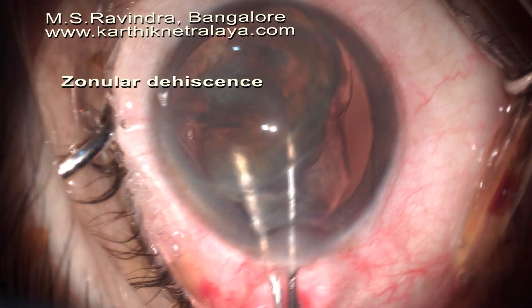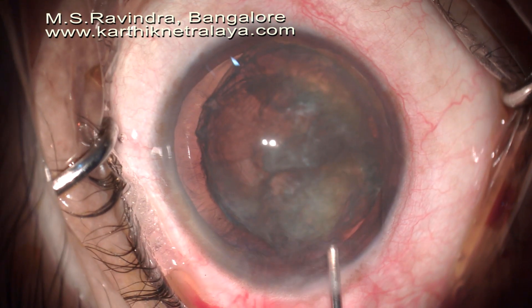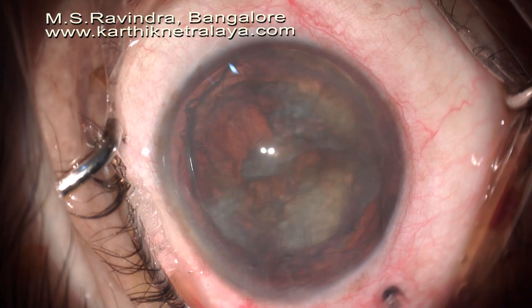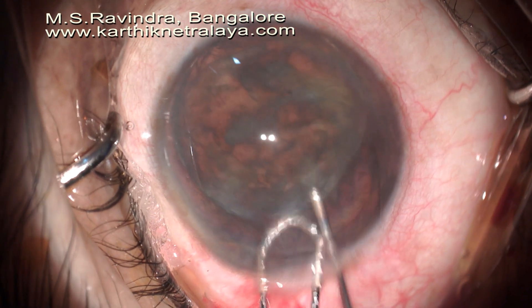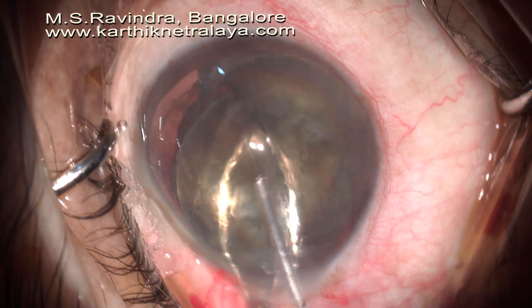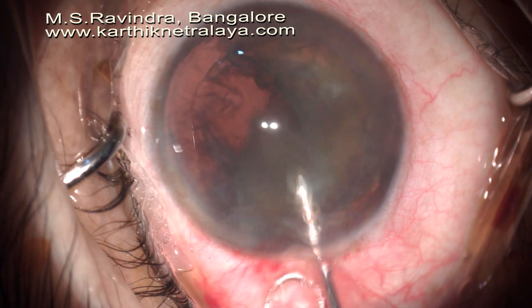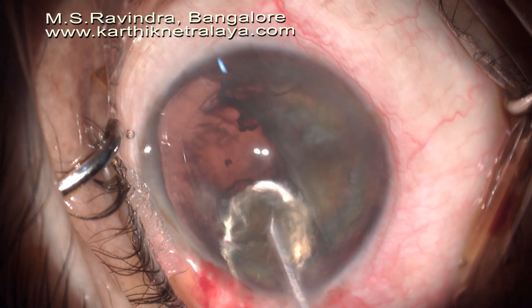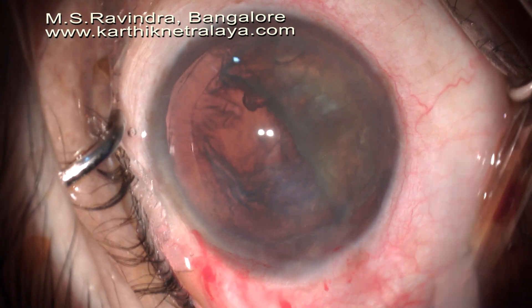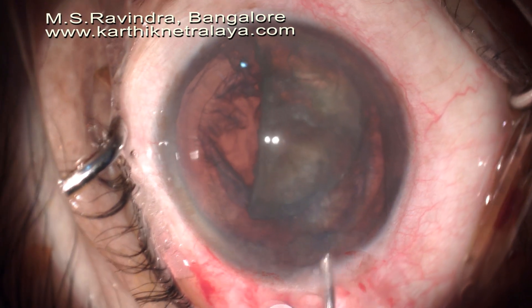The capsule prolapsed as I was rotating the nucleus out of the capsular bag, but it was pretty easy to rotate it out. In spite of the zonular deficiency, I could easily bisect the nucleus in the anterior chamber under continuous irrigation of viscoelastic on the nucleus as it migrated out of the eye. I brought the second half of the nucleus in line with the tunnel and there was no vitreous presentation during the entire surgery.